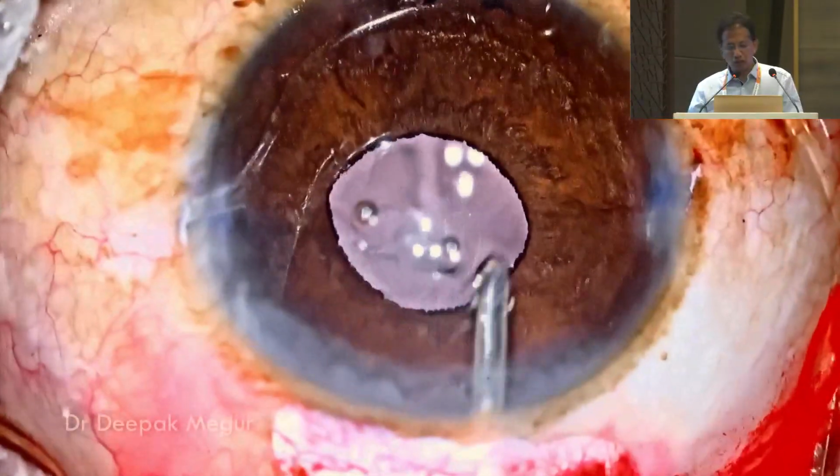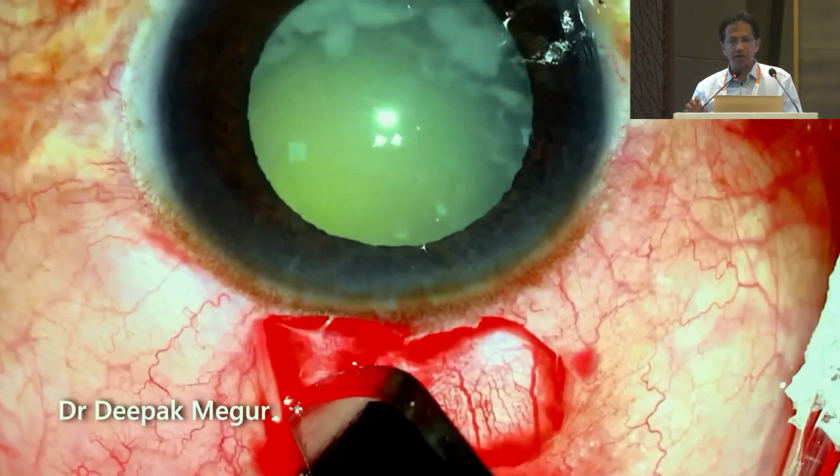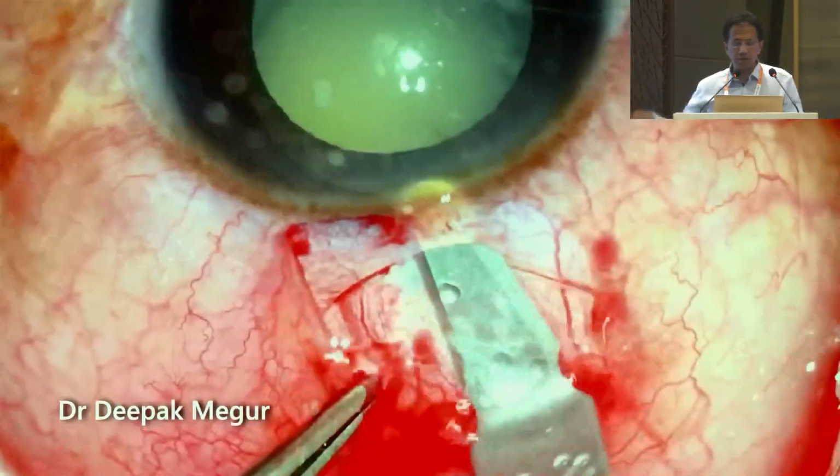So you'll have some amount of ovalization, but if you can enclave in the mid-periphery, you don't see that horizontal cat's eye pupil or the horizontal ovalization. So that's the trick. You have to enclave in the mid-periphery.